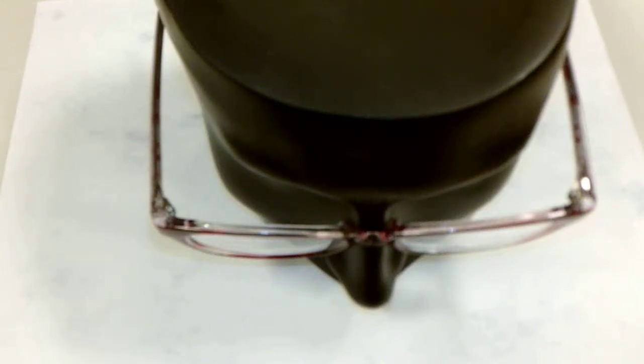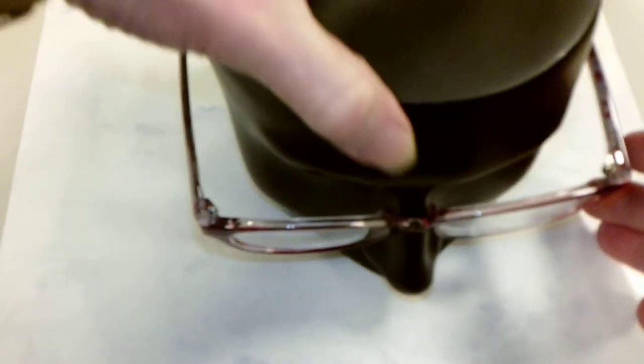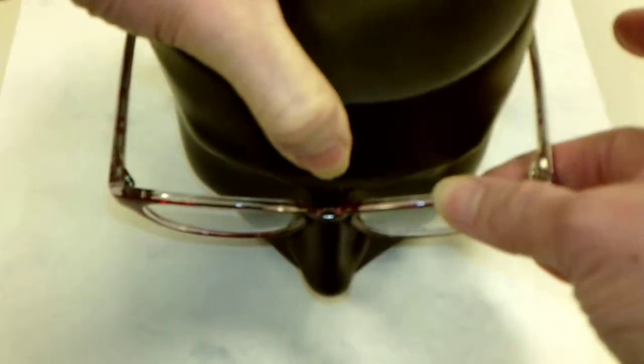How to adjust eyewear that is sitting crooked on the patient's face. This is my patient and her eyeglasses are sitting too low on the right side of her face.